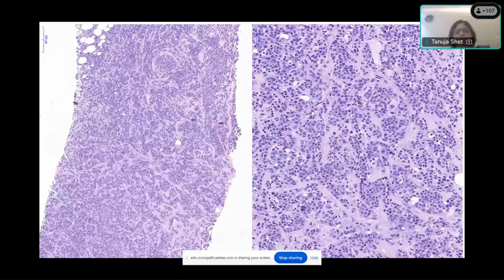Now here is a tumor. What kind of pattern is there here? Anybody wants to tell me? No? Anybody? Yes, please tell. I can't see you because that's the WebEx platform. So that's great, right? I don't know who I'm asking questions, who's answering. So you see, this looks like the alveolar pattern, right?